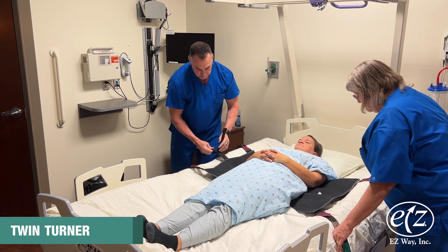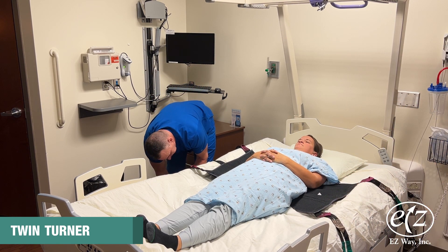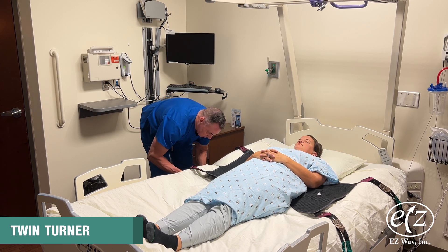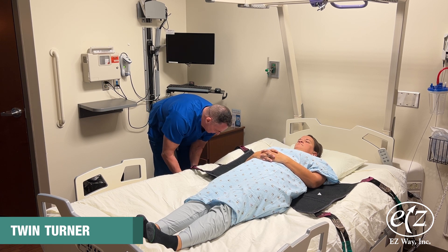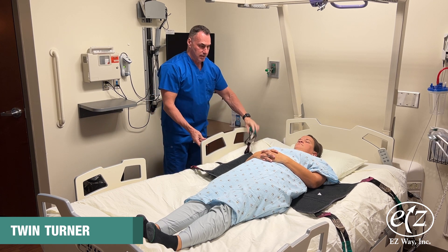On the side where the patient will be turned, use the velcro strap to attach the sling securely to the bed or other solid attachment point located on the bed frame. Do not attach to the side rails. Make sure the side rails are raised on the side of the bed where the person will be turning.